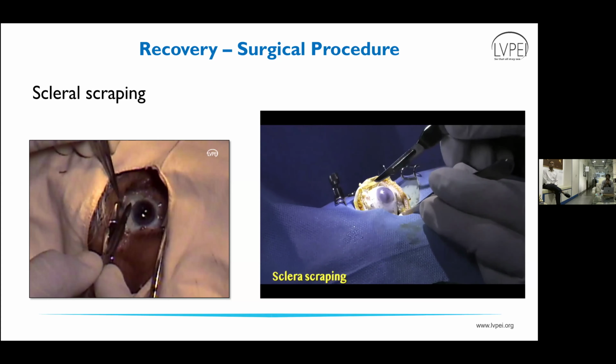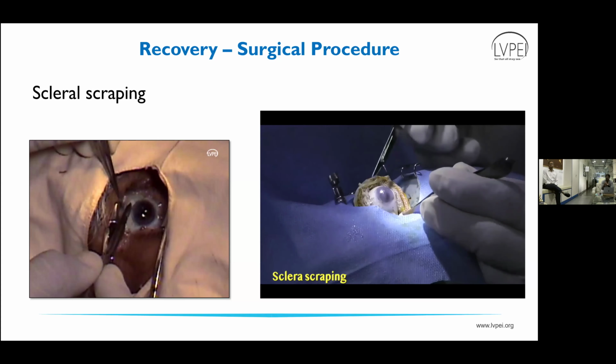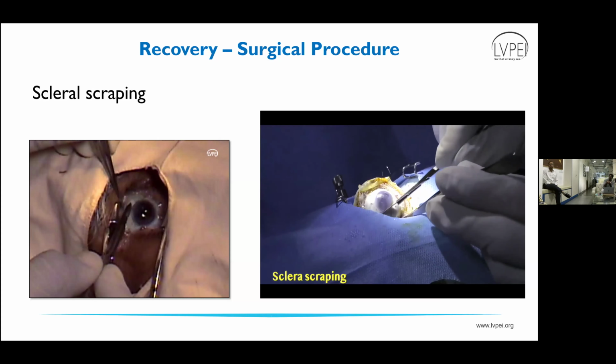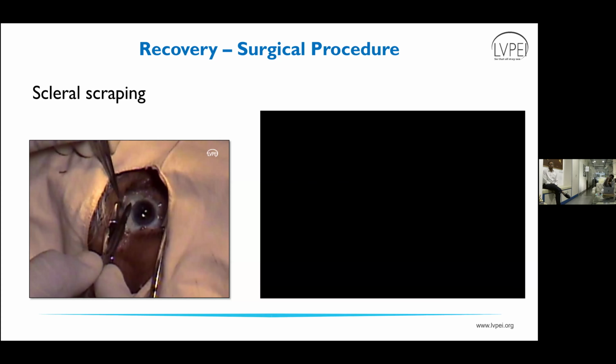Start from the limbal junction and scrape downward. Once you are done scraping downward, you should not come back the same way again. Again, you have to start from the limbal junction only. Likewise, you have to do the scraping 360 degrees, and it should be continuous.